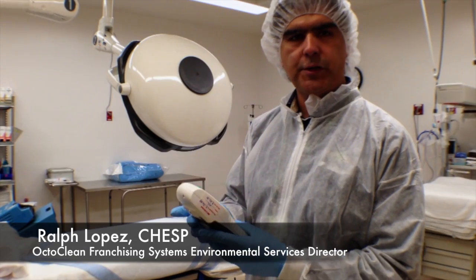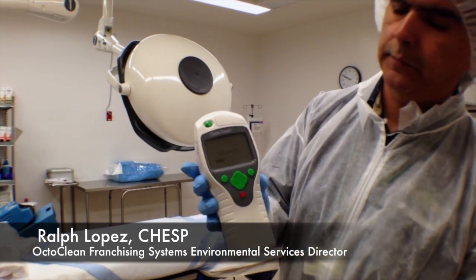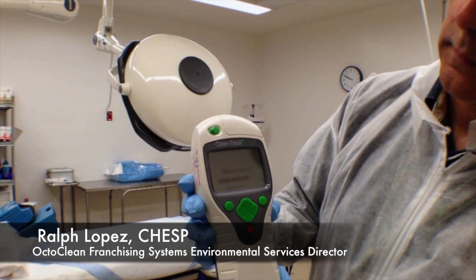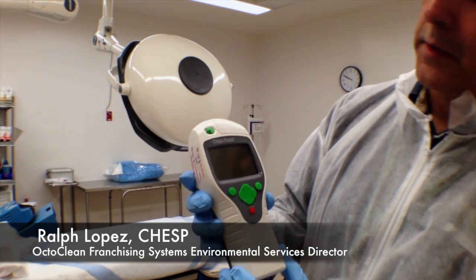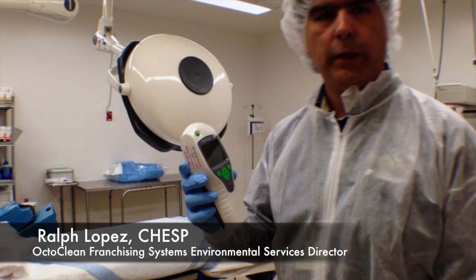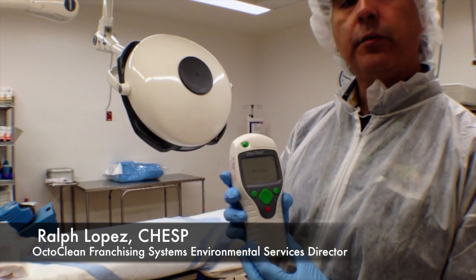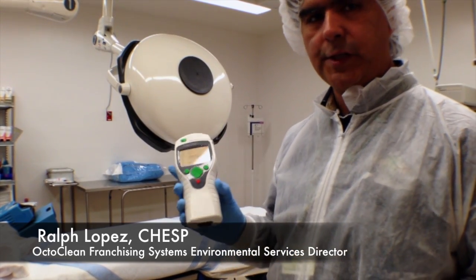We're going to measure our sample — and now we're measuring. So we went from an original reading of a little over 10,000 relative light units down to 367 relative light units. We've definitely got a very clean surface now.